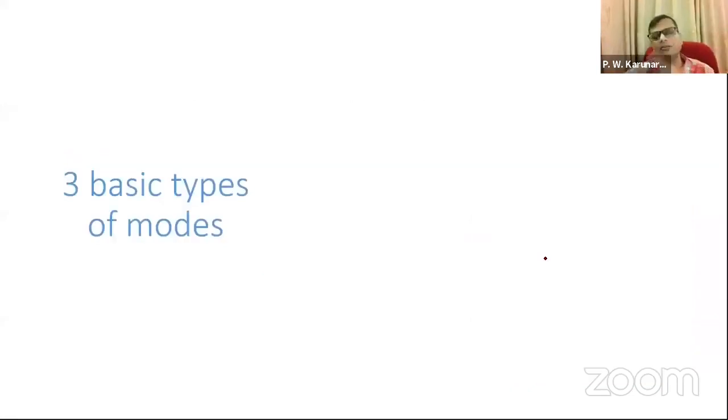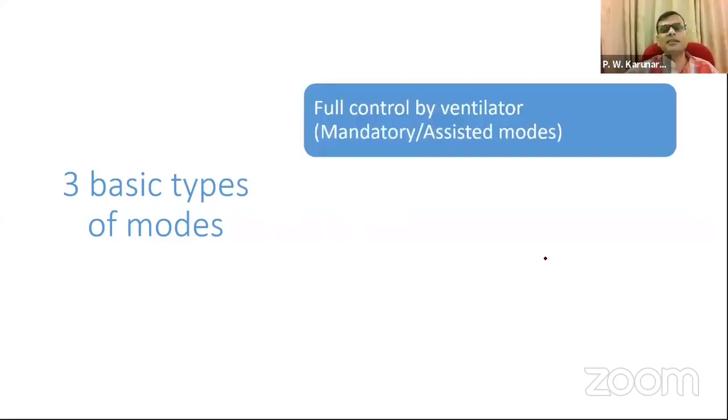There are some 300, 400 types of modes, but we are not going to learn all these things, and it's not necessary for you to learn all these modes. If you know the simple basic modes, I only use a couple of modes, and that is enough for you to save a patient.